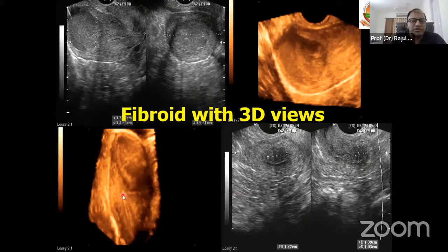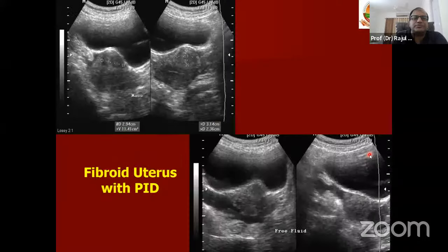going for endoscopy. So in this case, we can see that it is intramural and subserosal, but it is sparing the endometrial cavity. So this is a small hypoechoic fibroid which was lying in the submucosal location. So it is difficult to treat, and at times it's often missed. So we have to look at the endometrium very carefully, because here the only criterion was the displacement which caught our eye, and we were able to find out the cause for the pervaginal bleeding and lack of conception.